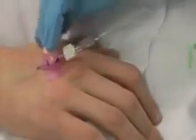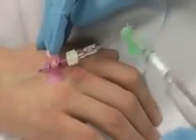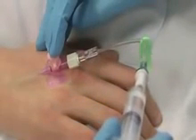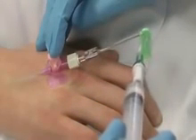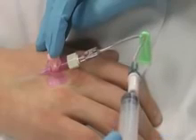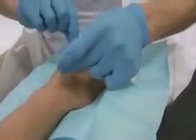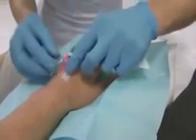Gently inject the flush, making sure there is no swelling or pain around the site as you do this. Now secure the cannula using the strips of tape over the wings, making sure you don't obstruct the view of the entry site.